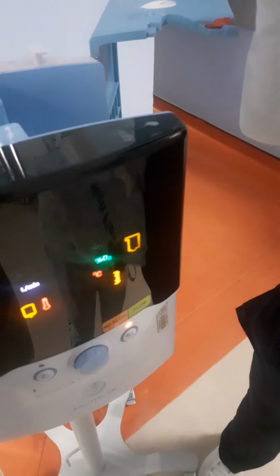In here, you'll see there is a space for this cassette. We won't open it up because we're not using it, but otherwise, you insert the cassette in here, then you spike it to water. So this is essentially your humidifier. It is spiked to water for irrigation, and then it will humidify the air and take it to the patient. This is where you connect your nasal prongs.